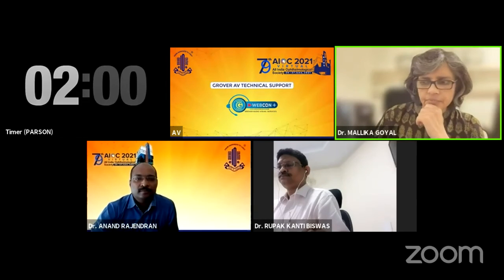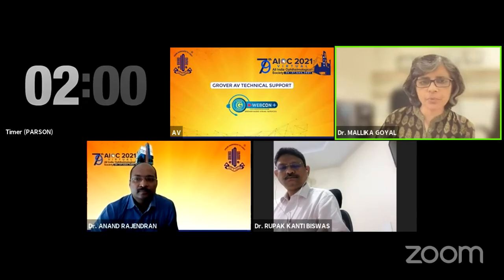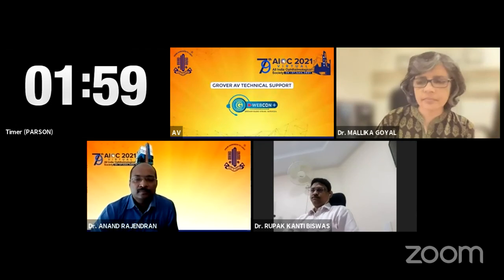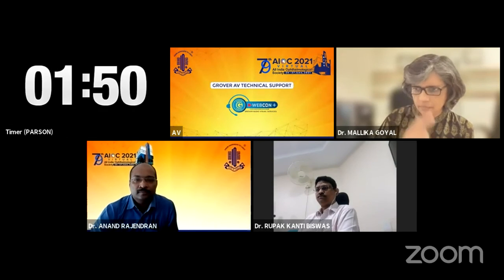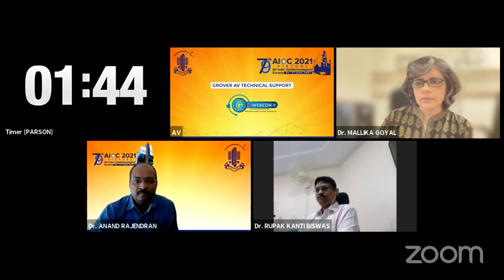Doctor, for these various things that you saw, the multimodal imaging, can any of these help you with the prognosis? Prognosticating a case? Mainly the multifocal ERG gives the functional assessment, and we have compared it with best corrected visual acuity also, and we have found it has correlated positively with best corrected visual acuity.